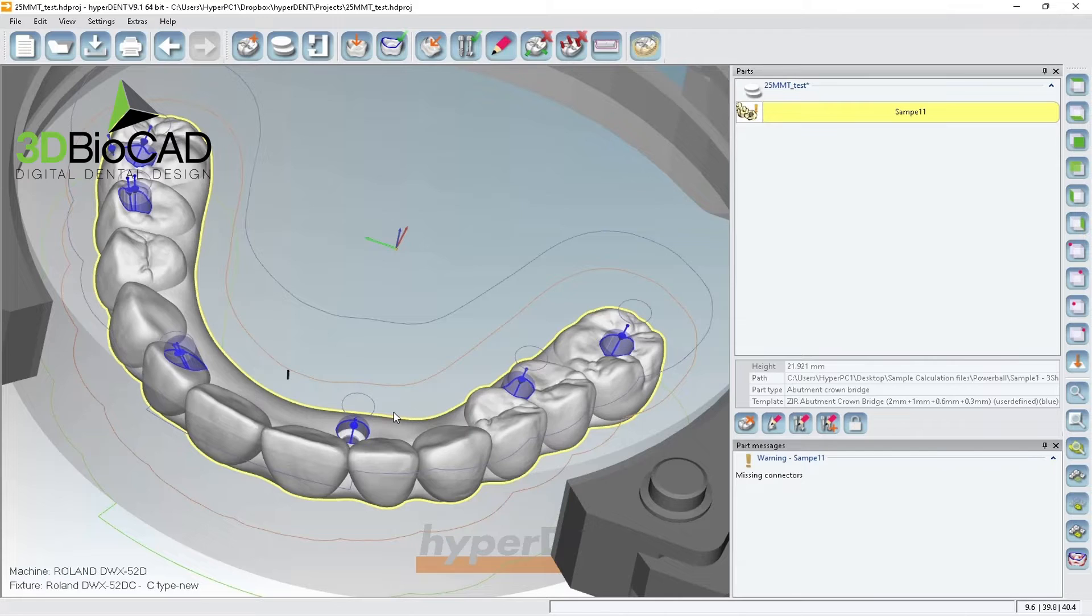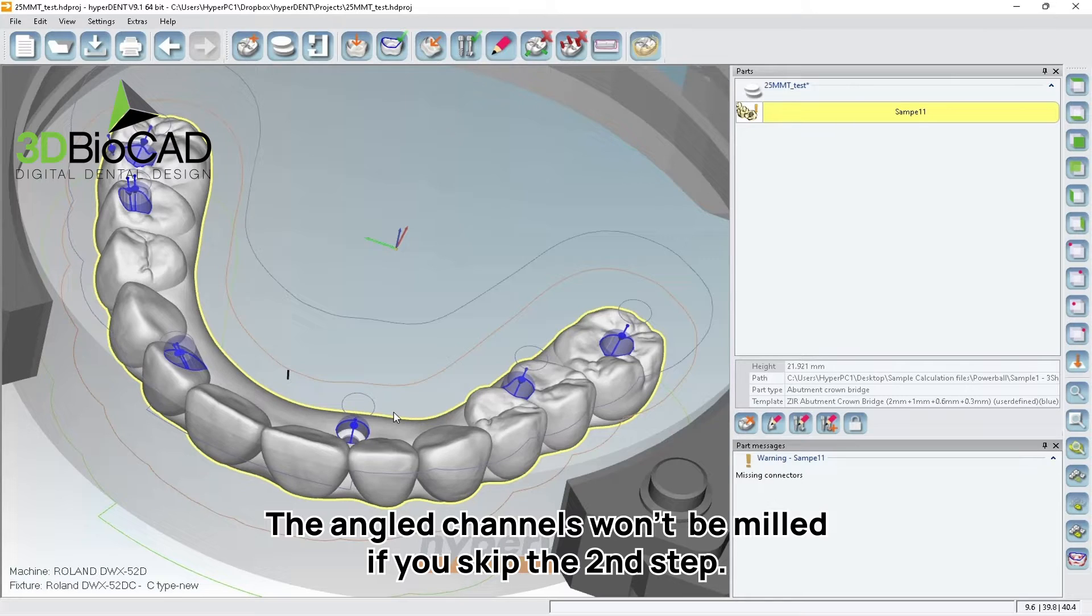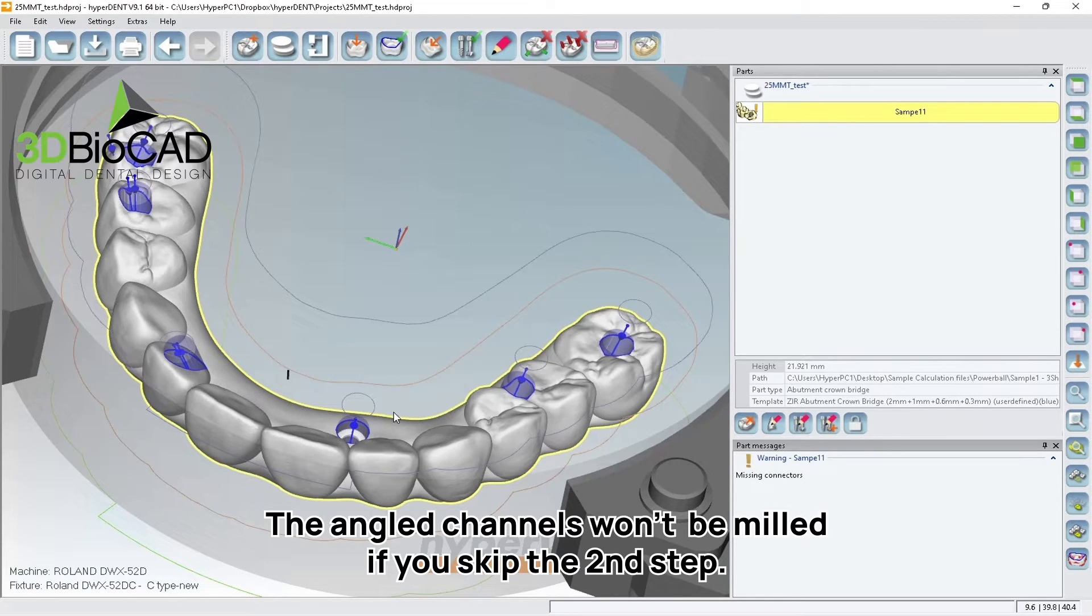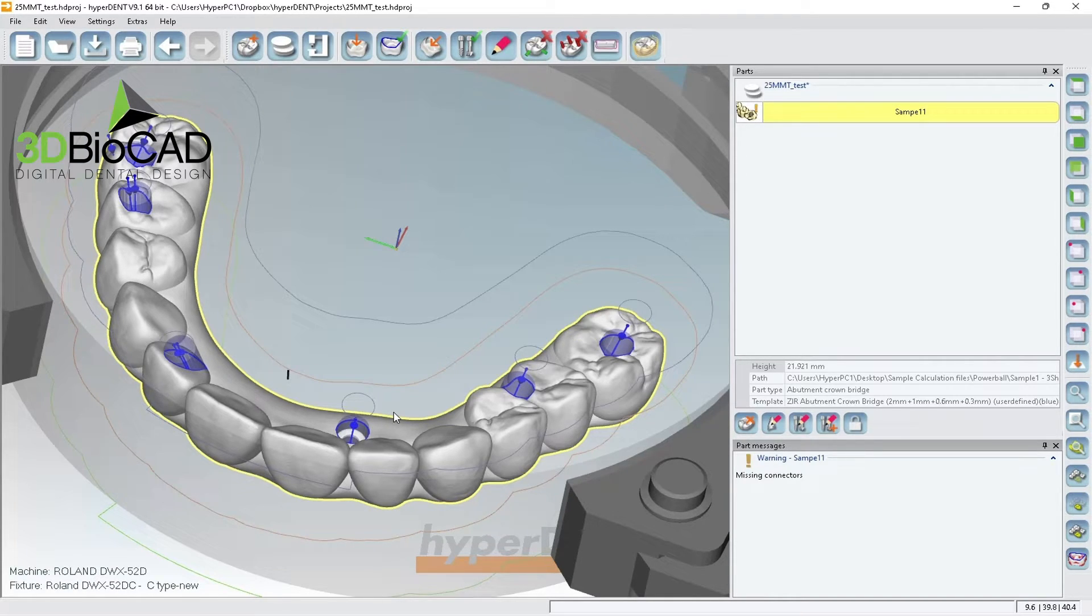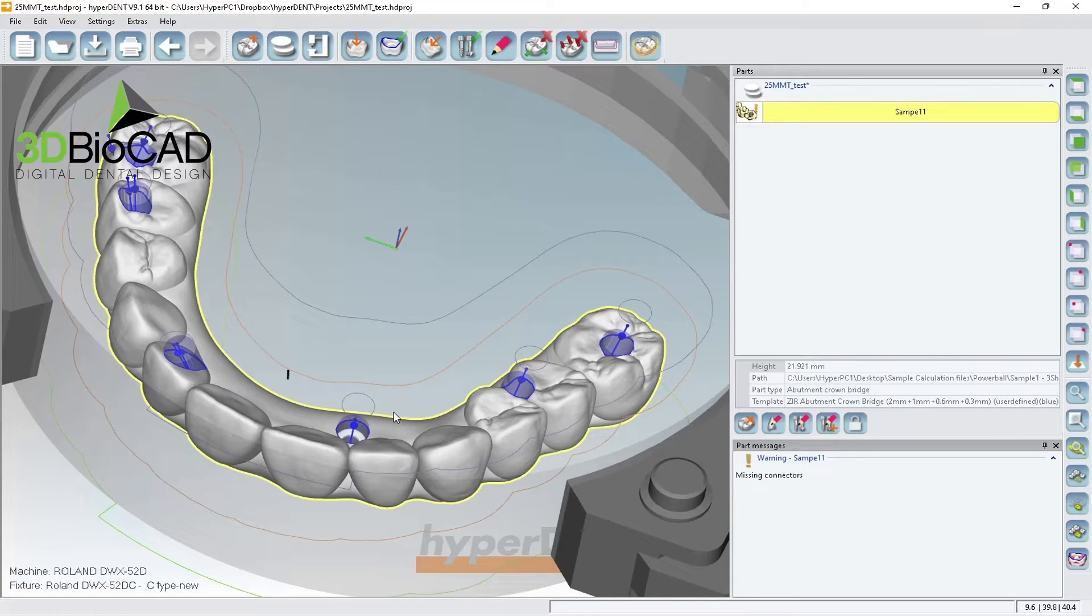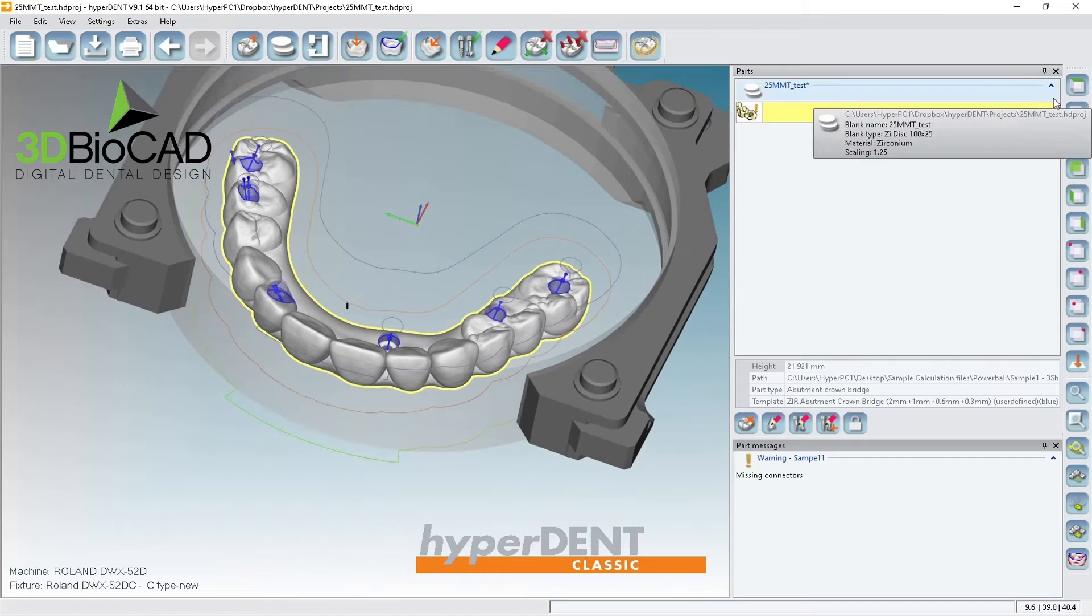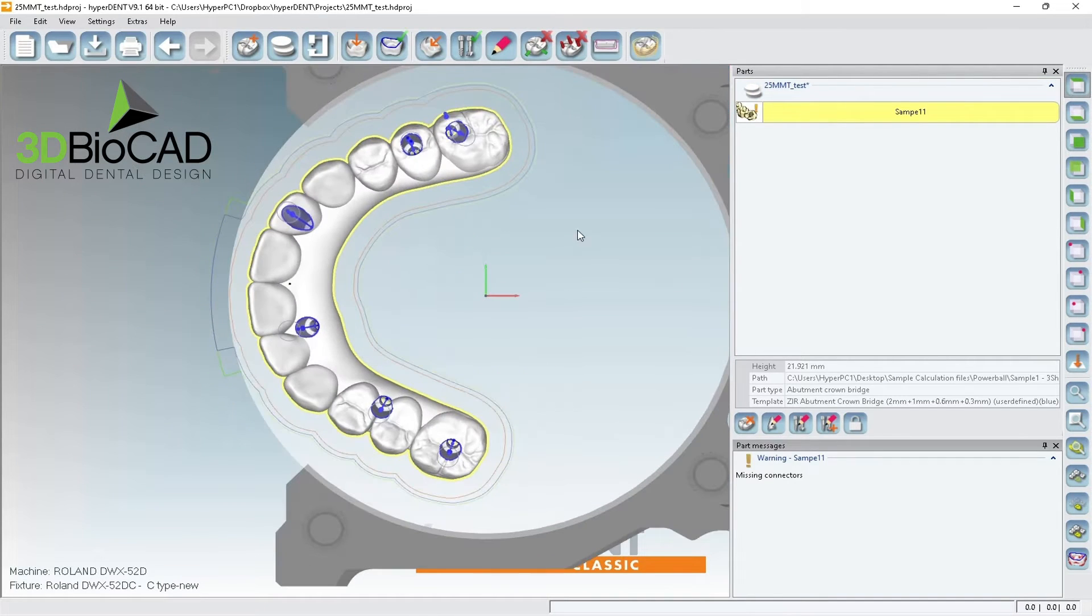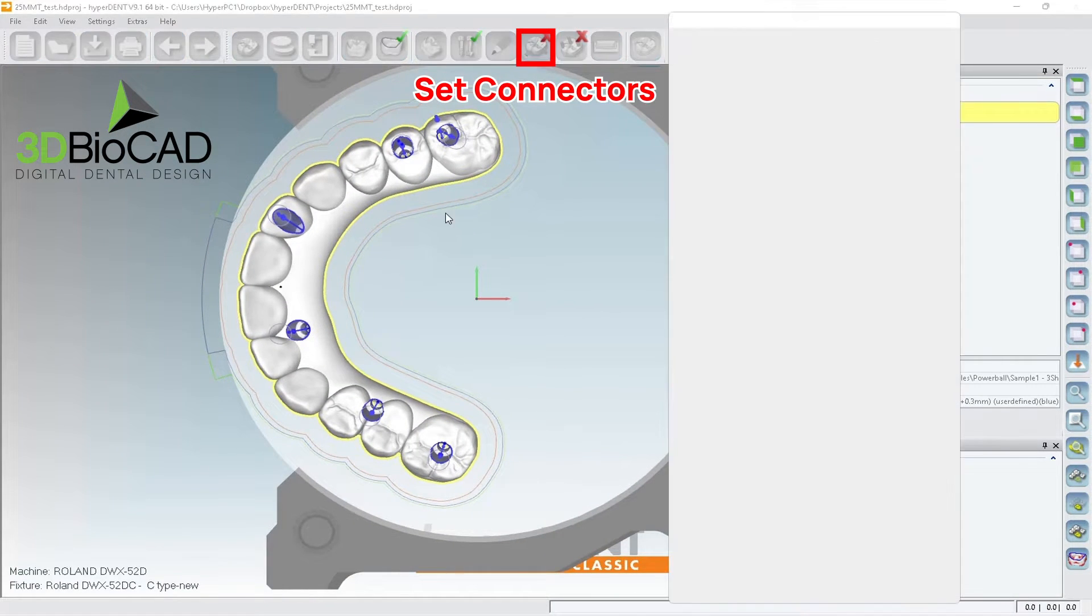And also, after you mill, the angle channels are not going to get milled out. So that's how you also know you need to do second step. So if the screw, before you remove everything, make sure you check and see if your screw channels are all milled out. All right. So just like previously, we want to put the connectors.